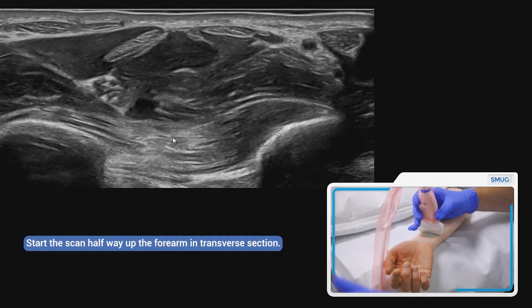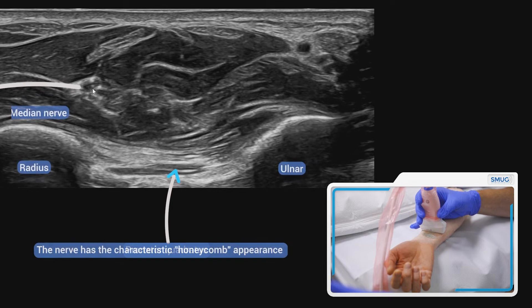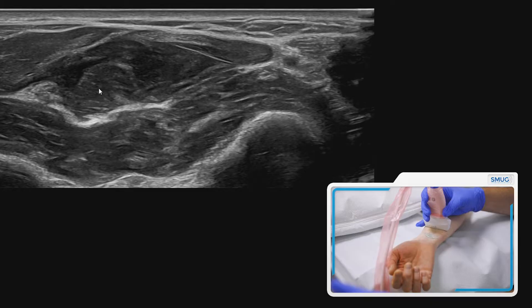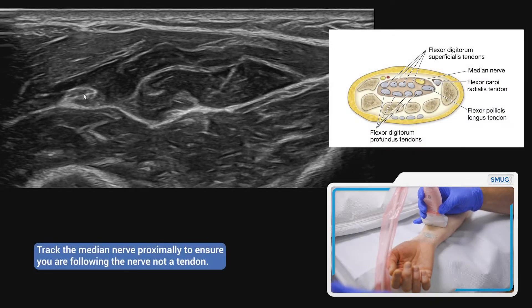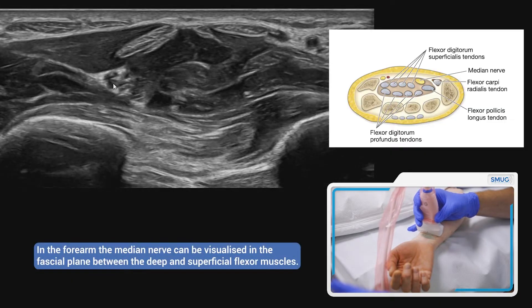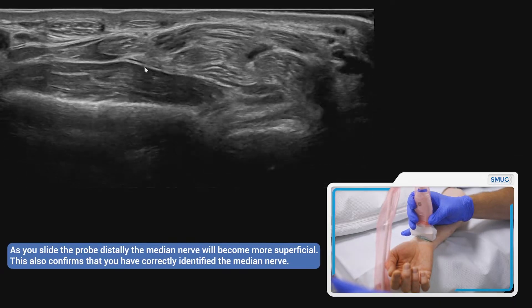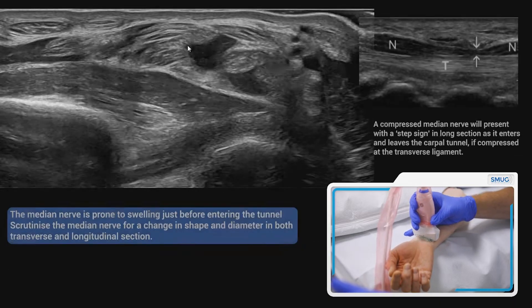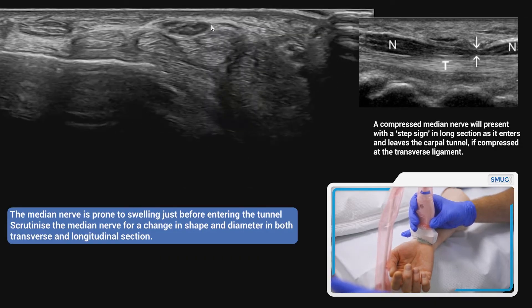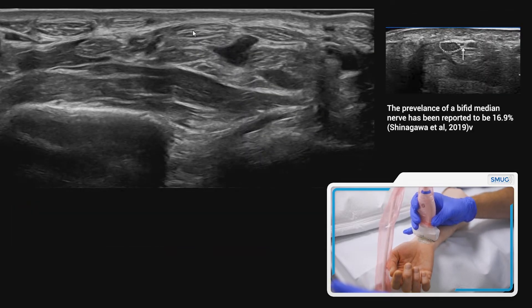If we go further up the arm you'll see the pronator quadratus muscle, and in the middle of the forearm you'll see something with a honeycomb appearance — that is the median nerve. Further up the arm it sits in a fascial plane, and as we go distally it moves more superficially. You can see it pushing the other tendons aside, coming up just underneath the retinaculum visible at the top of the image — that is the median nerve.